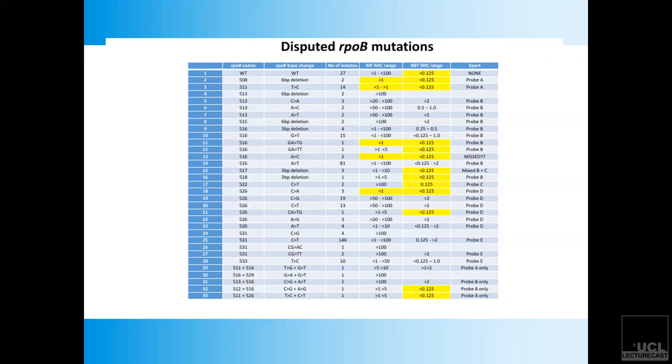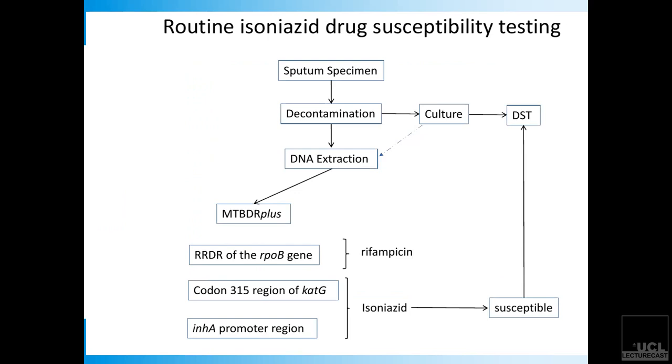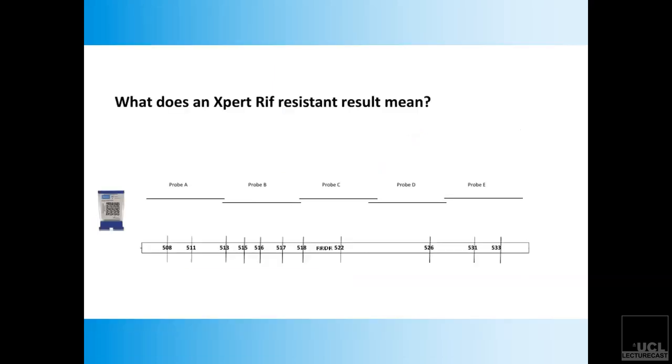If that's the wild type, if it is complementary to your sample, then it binds, and then hybridization, you see a band. So almost like an HIV strip. Each band has got oligos which represent particular mutations. So when you look at that banding pattern, you then determine whether it's resistant or sensitive to the drug.